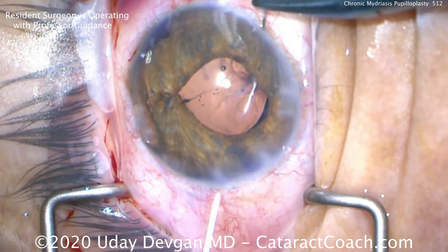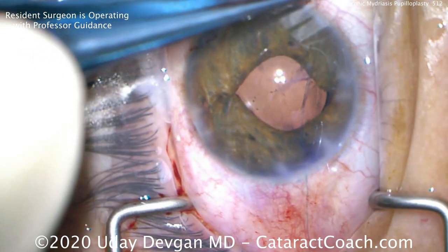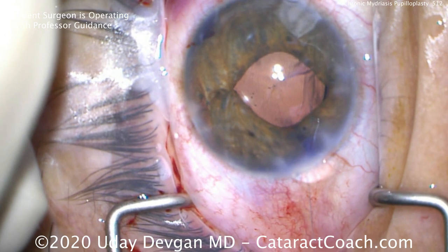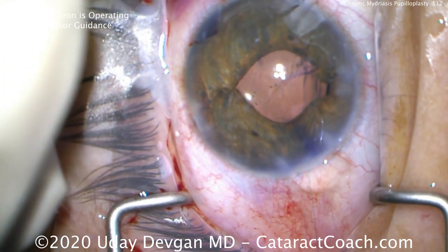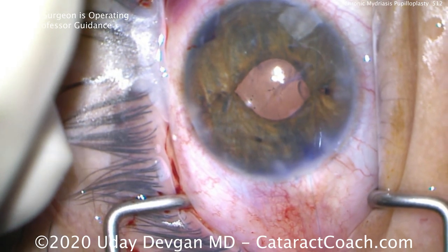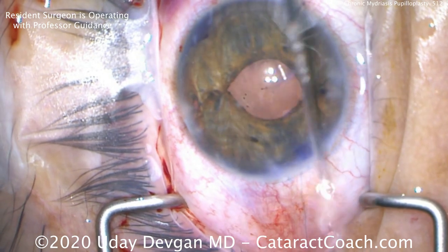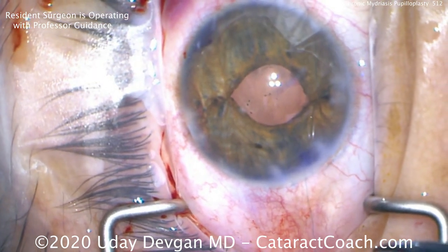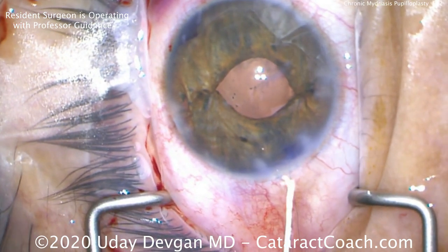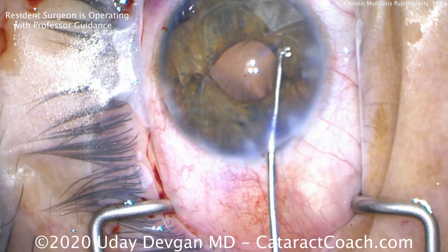Again, we poke through the limbus using the 10-0 prolene on the CIF-4, then come out the other side through an incision. We do the four-throw pupilloplasty as learned from Dr. Agarwal and bring it together nice and slowly. That's a beautiful result. Again, this knot is 4-1-1. Then we'll tie it completely, and when it's nice and secure, we'll cut the ends with the micro-scissors and be done with this.